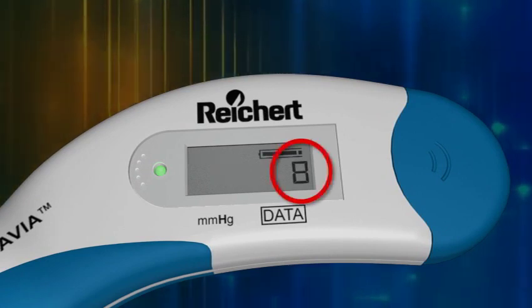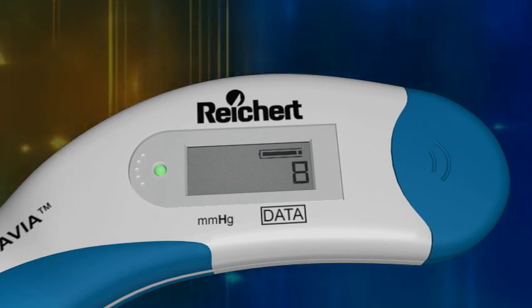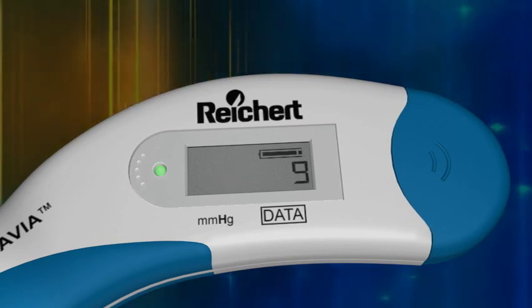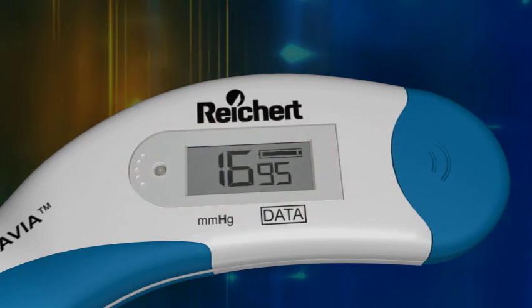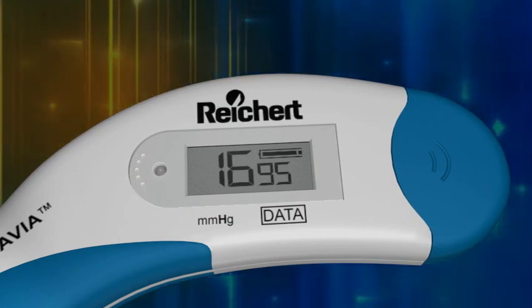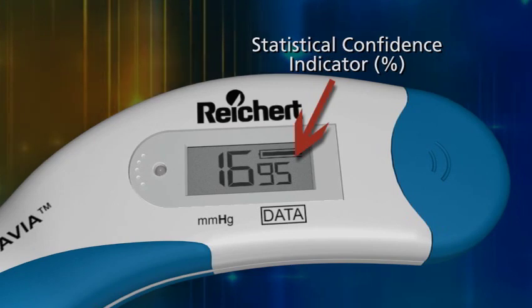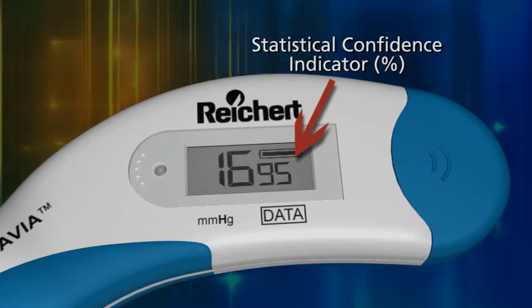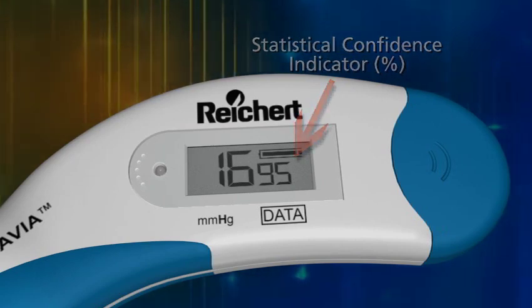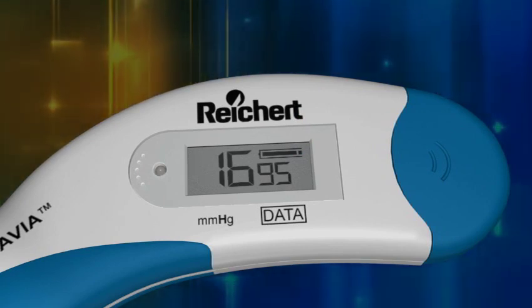The data field of the LCD registers the number of readings obtained. The Tonopen Avia Tonometer takes 10 readings and displays the average. After 10 readings are obtained, the device will beep and the LED will go out at the end of the measurement. The IOP reading is immediately displayed on the LCD. Notice the smaller two-digit number to the right of the IOP measurement — that is the statistical confidence indicator expressed in percent. The higher the statistical confidence percentage, the more reliable the reading. In this example, the average of the readings is 16 millimeters of mercury with a statistical confidence indicator of 95 percent. This represents a very reliable measurement.